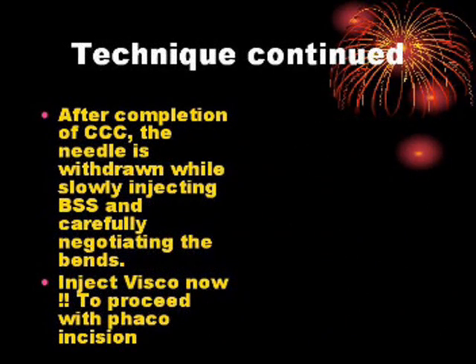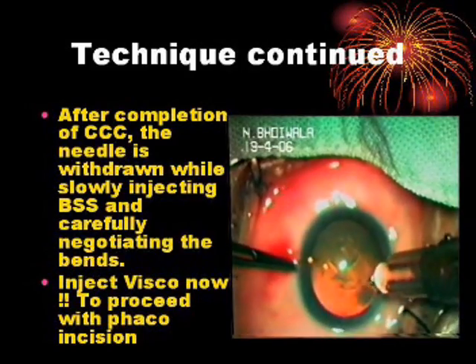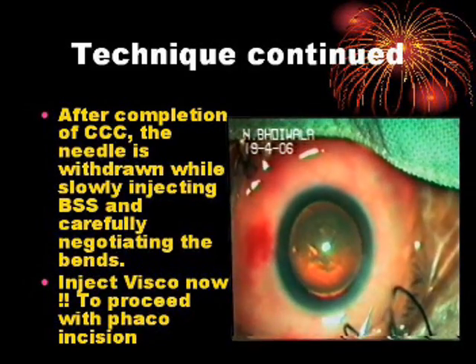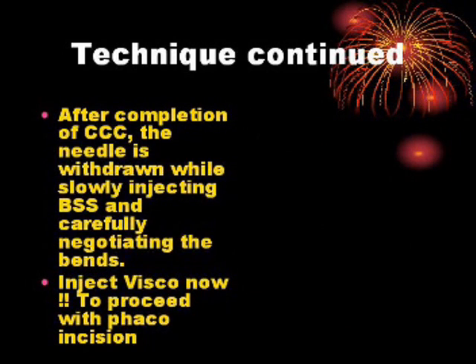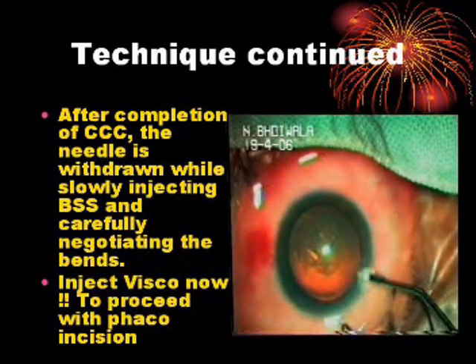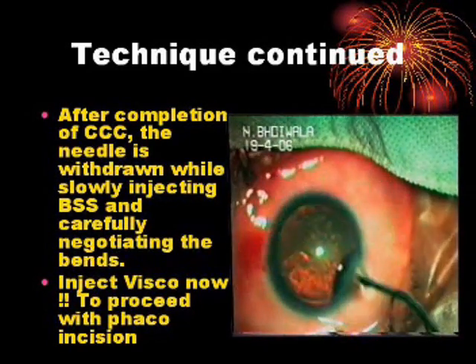Technique continued. After completion of CCC, the needle is withdrawn while slowly injecting BSS and carefully negotiating the bends. Inject viscoelastic now to proceed with the phaco incision.